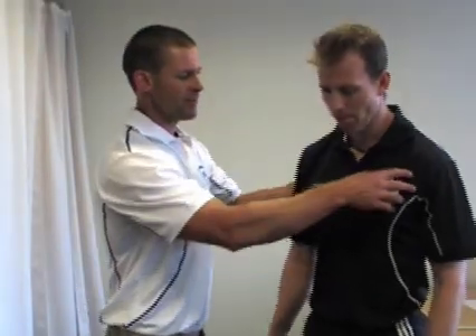What we'll go through first is the bicep and tricep. With the bicep and tricep, we take all our skinfold measurements on the right hand side of our clients. There is no need to do it on both sides — all the normative data is based on taking one skinfold measure on the right hand side.